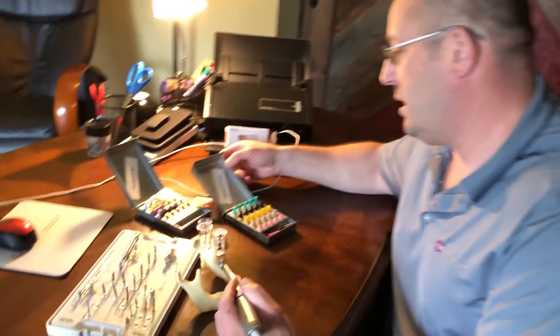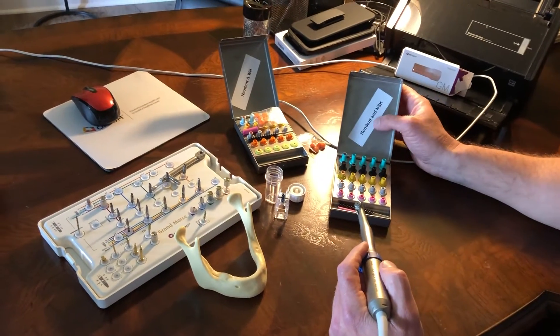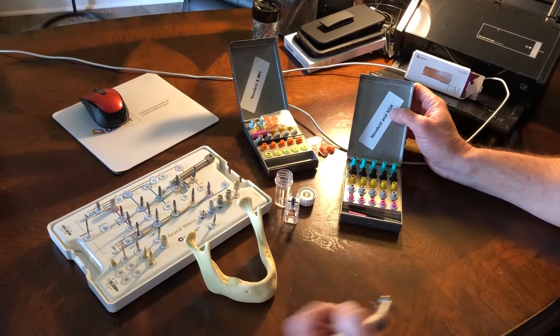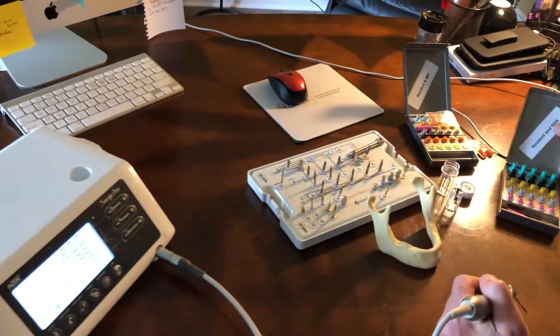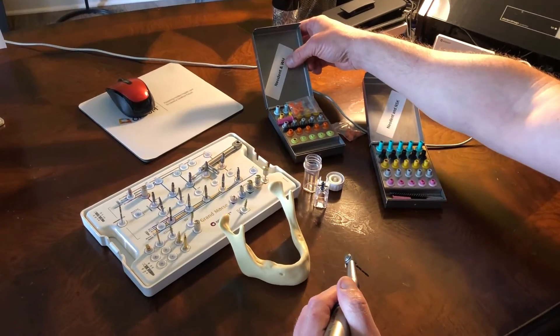If you will take a look, we have two kits in particular. There's the Neodent for the NSK handpiece — that's the drill unit we're using today — and then we also have the W&H, which is very popular in a lot of offices.